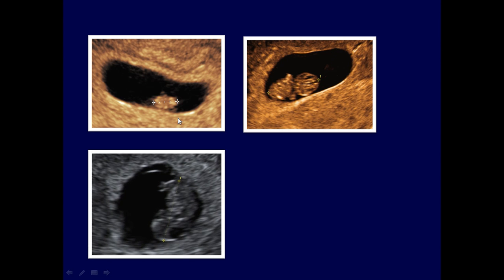At 8.3 weeks, the embryo has a C-shaped configuration. The cephalad becomes prominent and contains an easily visible sonolucent structure. It is the developing rhombencephalon. The rump might reveal a tail-like appendage.